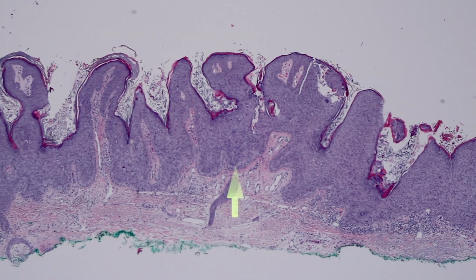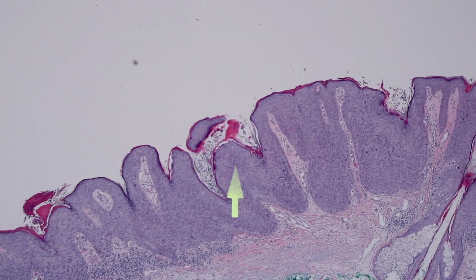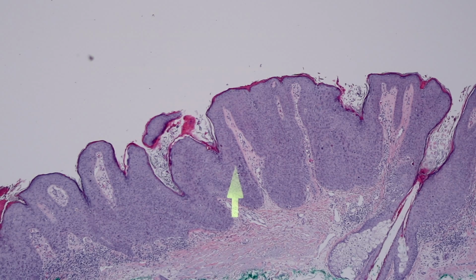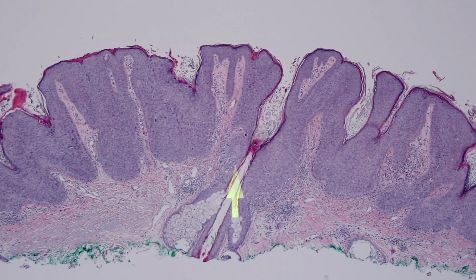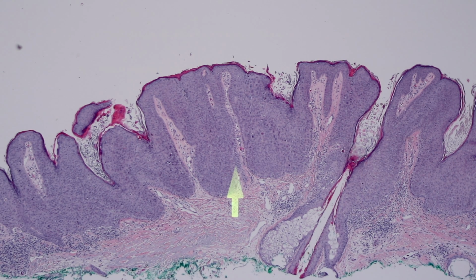If you see something like this, though, and it's in the anogenital area, then I actually call it HSIL. And for my dermatology colleagues, some of them are not familiar, since that's a newer terminology that is more in the gynecology world and less in the dermatology world. So I usually put a comment, high-grade squamous intraepithelial lesion, and then say this is the current terminology that we use for HPV-driven squam in situ, or HPV-driven high-grade dysplasia of the anogenital area, and it encompasses squamous cell carcinoma in situ and bowenoid papulosis, which looks basically just like this, but it's really a clinical term. And so I add that comment.